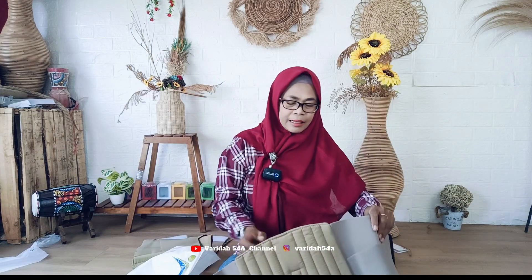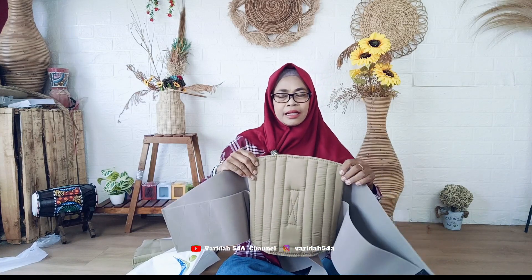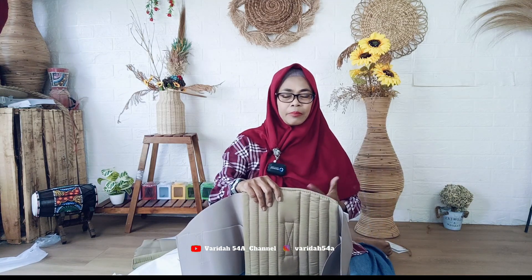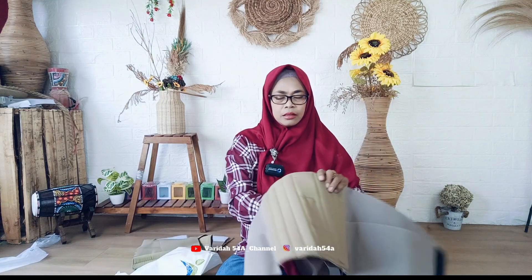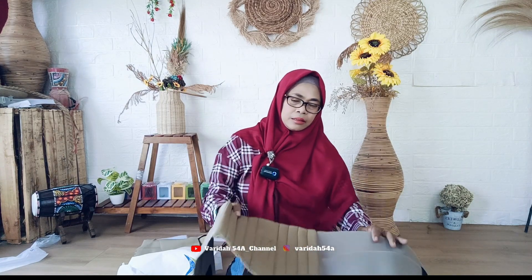Merk Stella ini lebih bagus dan harganya untuk ukuran XL saya belinya di harga 200 ribu, tidak mahal-mahal sekali, tapi kualitasnya bagus. Selain untuk yang bermasalah dengan tulang belakang, korset ini bisa untuk mengecilkan perut, perut jadi langsing, dan bisa untuk ibu-ibu yang habis melahirkan, biar perutnya bisa langsing juga.